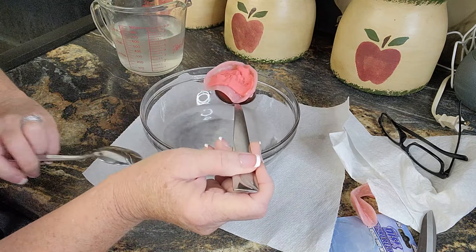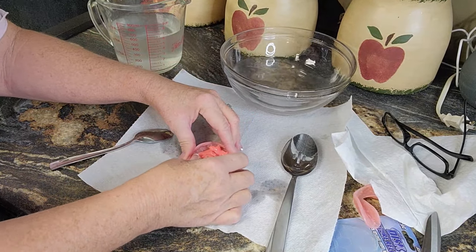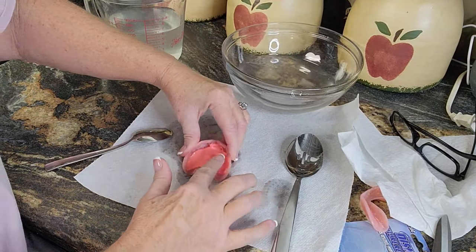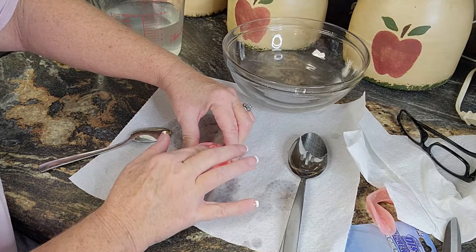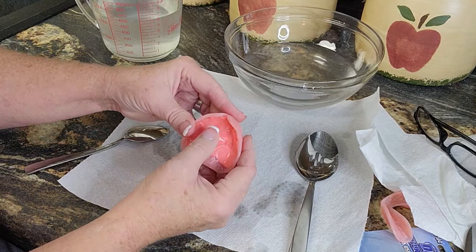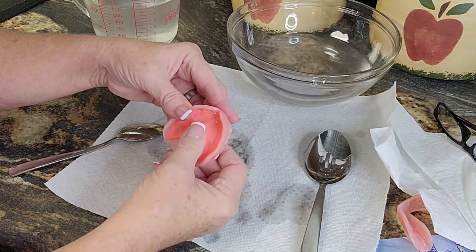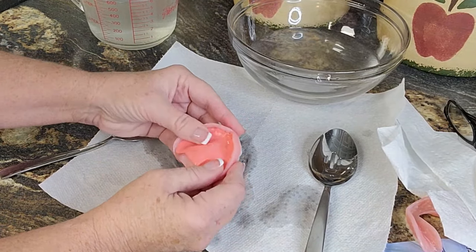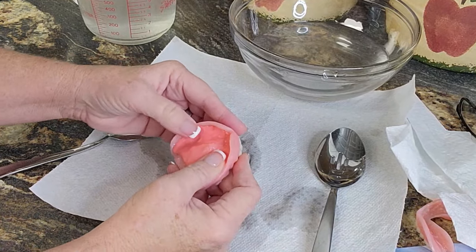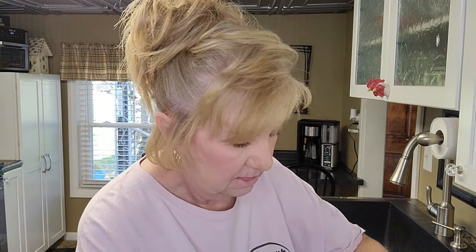I think it's moldable. All right, then you take it out of the hot water, and then you're supposed to be able to, oh look, it's not extremely hot right now. Okay, I see it. I see this happening. And then when it cools down, you put this thing in your mouth. You don't ever want to put anything in your mouth that's burning hot. That would be bad. And I could probably tell you, okay, while this is still warm, let me put these big things in. All right, you ready?